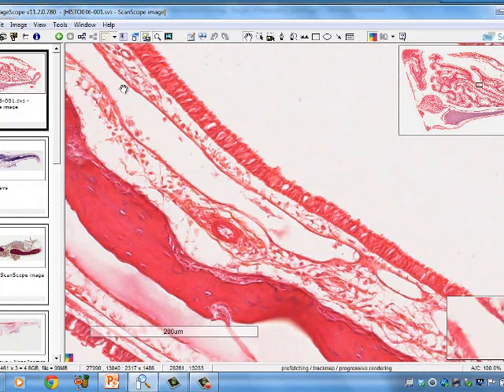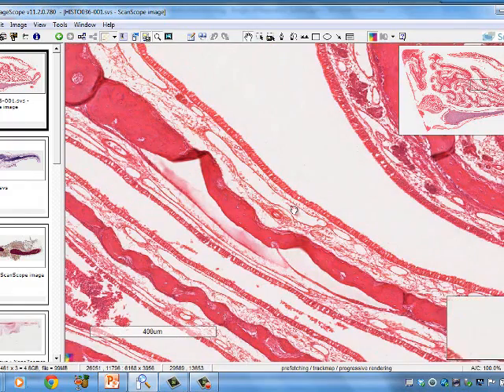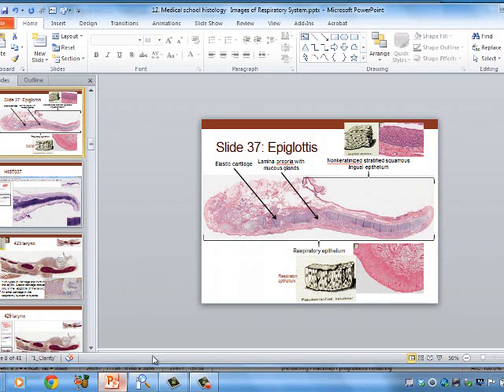These are the swell bodies that close the airflow down to one side or the other side. About every 30 minutes it switches between sides, and these vessels fill up with blood, and whenever they do, they close the airflow down to that side.